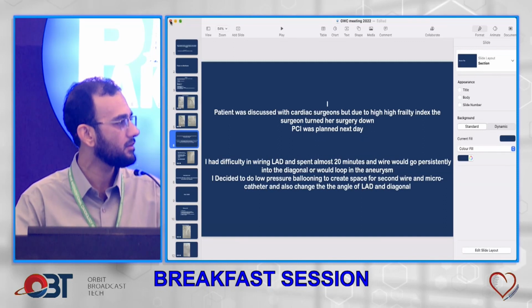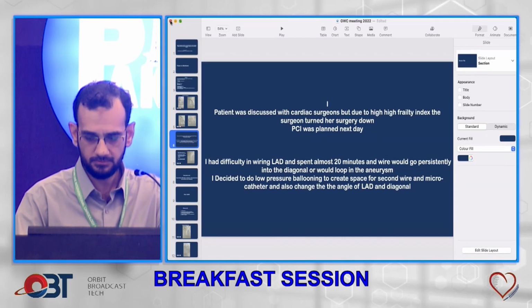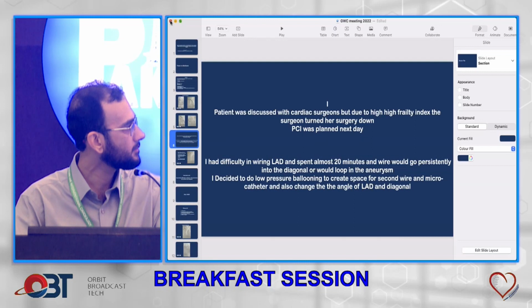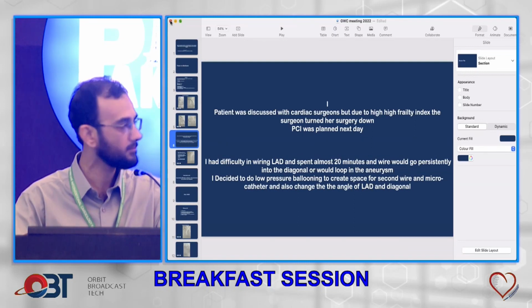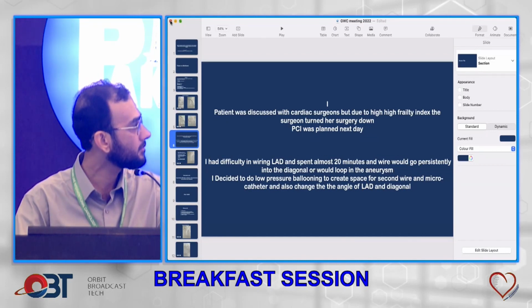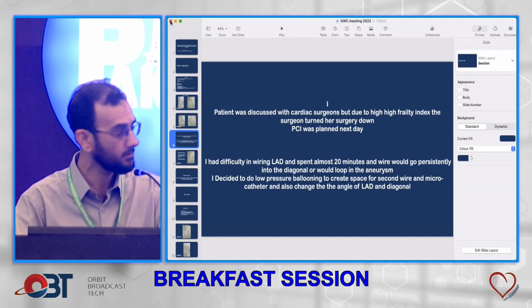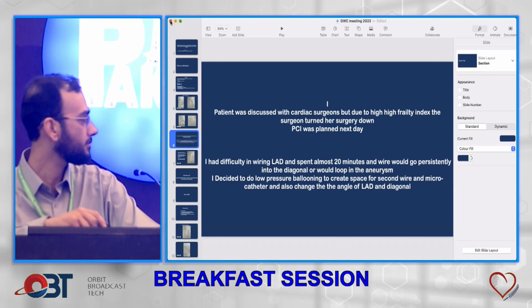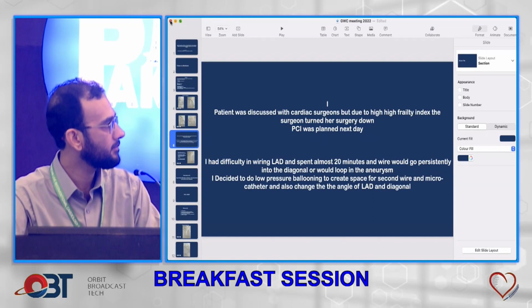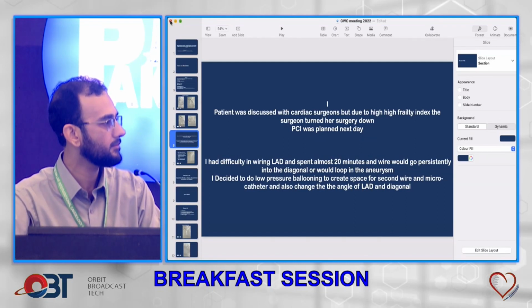Although it's strange, go back one picture. If you look at that, the diagonal ostium was clear of any significant disease. It didn't seem there was much disease at the LAD where the diagonal was coming. But after, I don't know, there was a dissection or something that probably resulted in shifting of plaque, the flap into the diagonal branch, resulting in that kind of severe compromise to the diagonal.